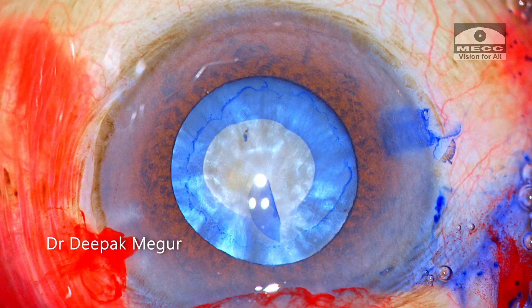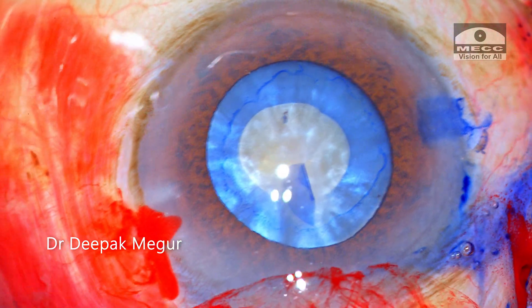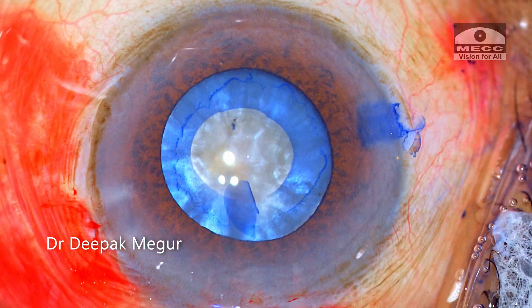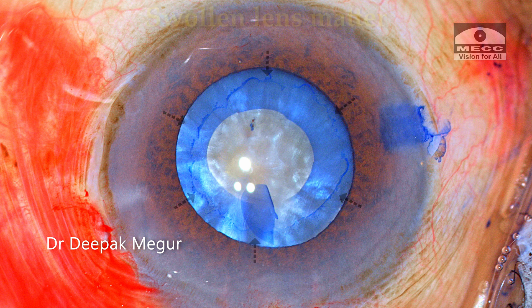Now the most critical part — I need to have a comprehensive decompression of the bag, as the risk of the rhexis running away still exists during the secondary rhexis and capsulorrhexis creation if the bag is not thoroughly decompressed. The swollen lens matter in the peripheral areas is what causes a problem, as does the lens matter which is behind the nucleus. All of this needs to be removed.